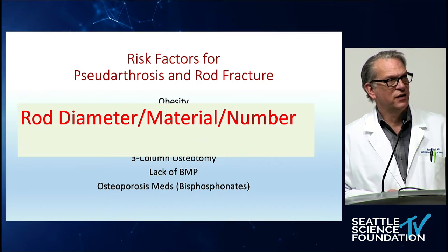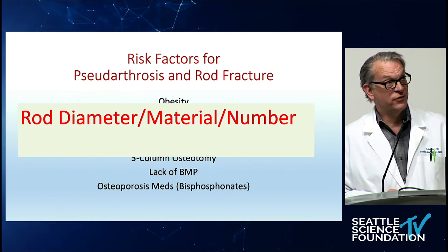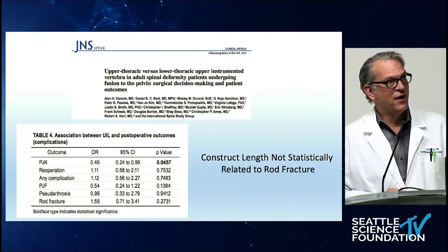And I would add to this, and what I'm going to focus on in this talk, is rod diameter, material, and rod number as a risk factor, in a way to mitigate the risk of rod fracture.